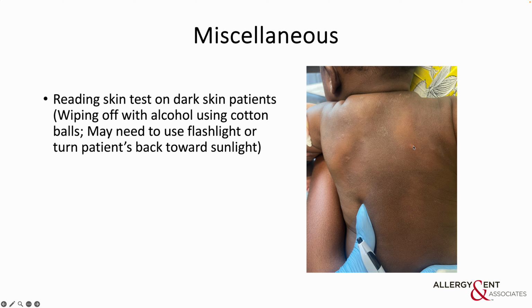So this is actually a positive control, and this is a positive test. We got some pseudopod. Here's the egg the patient is allergic to. It's so hard to read the redness here because it was placed on the area we call hyperpigmentation from the eczema skin. So it's so hard to read the skin test. We ended up repeating the egg again elsewhere when his skin's a little lighter, and it was a beautiful level 3 afterward. So this is a positive test.